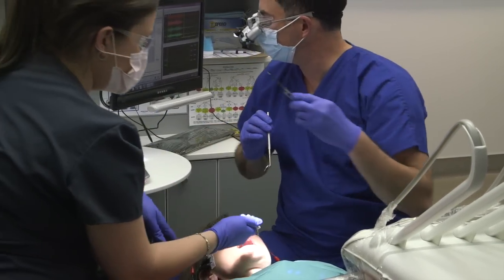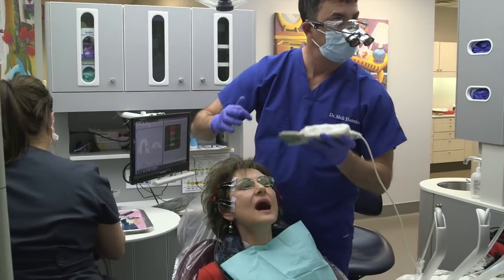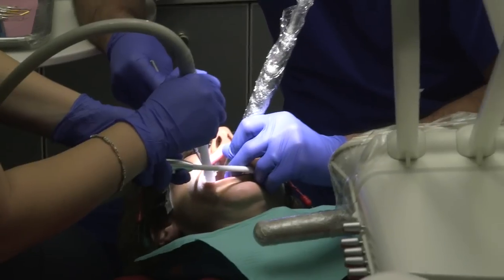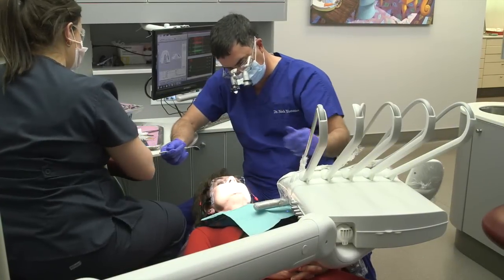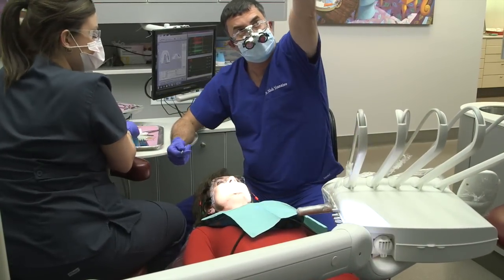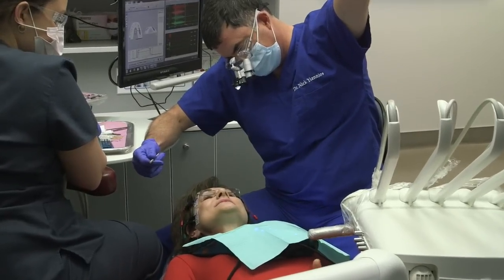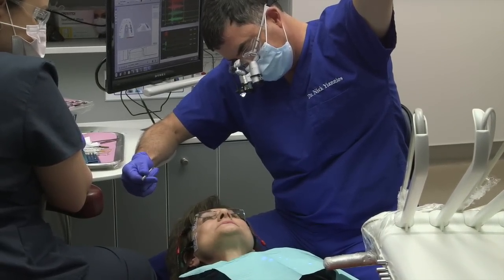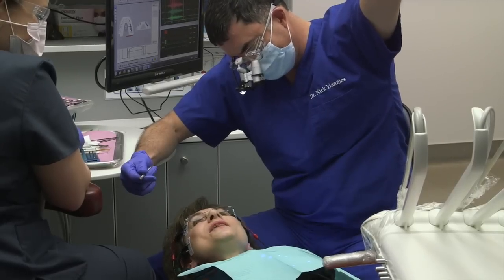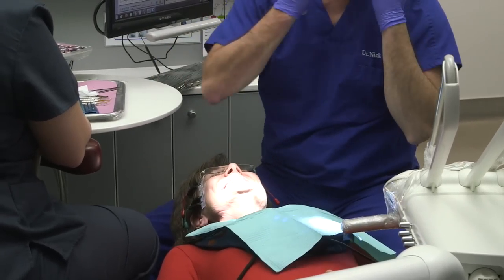Bite home hard, to the right, and open. How would you describe that subjectively? Smoother. Easier. It's not as tight. Does your face feel any different yet? It feels a little more relaxed. I hate that word, don't you? You sound like the videos, don't you? How funny is that?